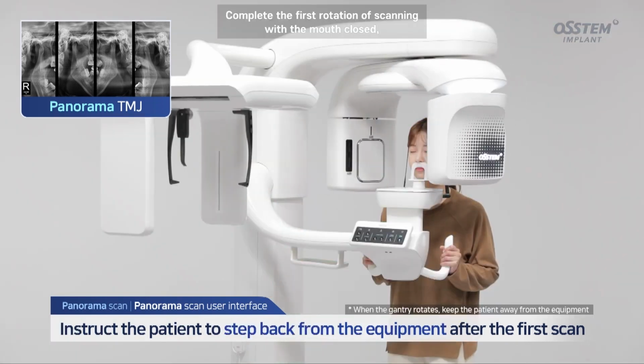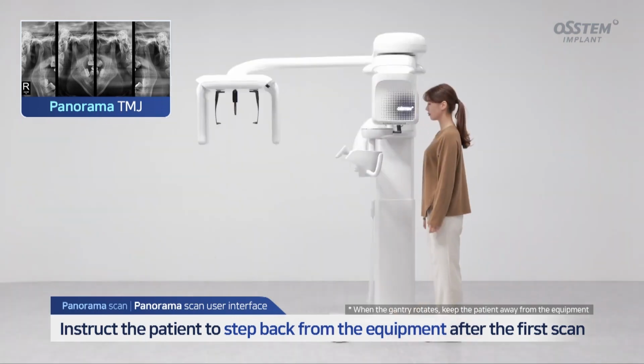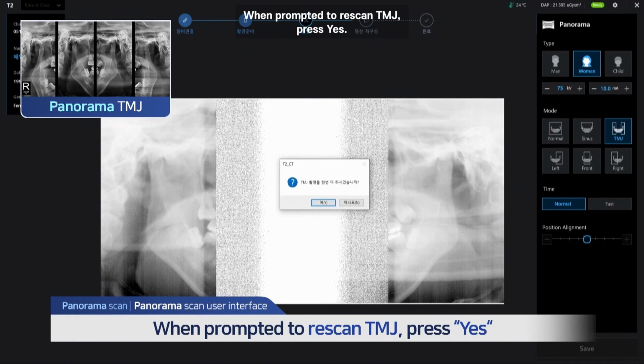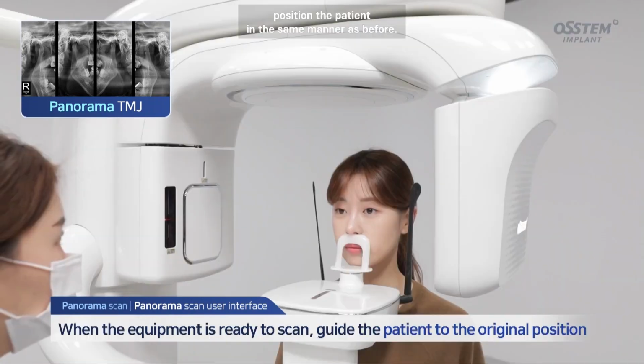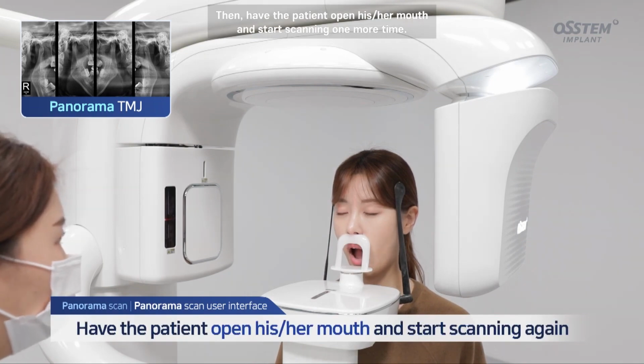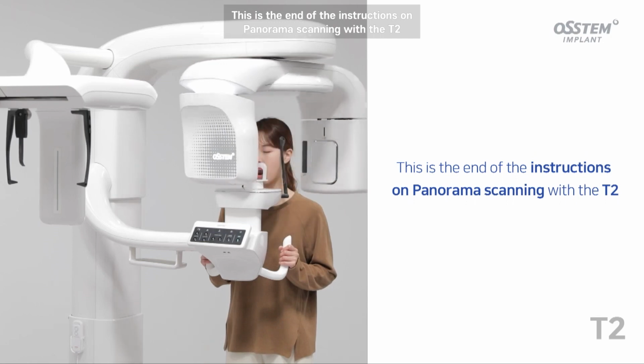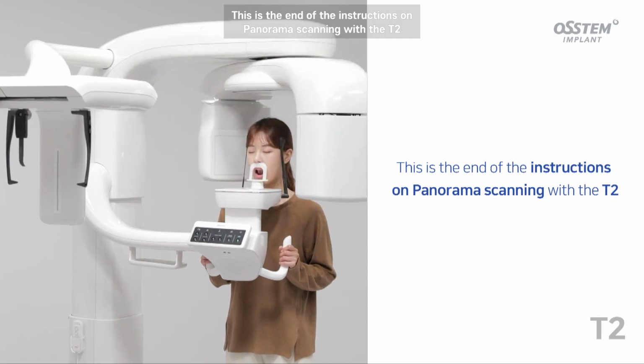Complete the first rotation of scanning with the mouth closed, and have the patient step back from the equipment. When prompted to rescan TMJ, press yes. Position the patient in the same manner as before. Then, have the patient open his/her mouth and start scanning one more time. This is the end of the instructions on panorama scanning with the T2.